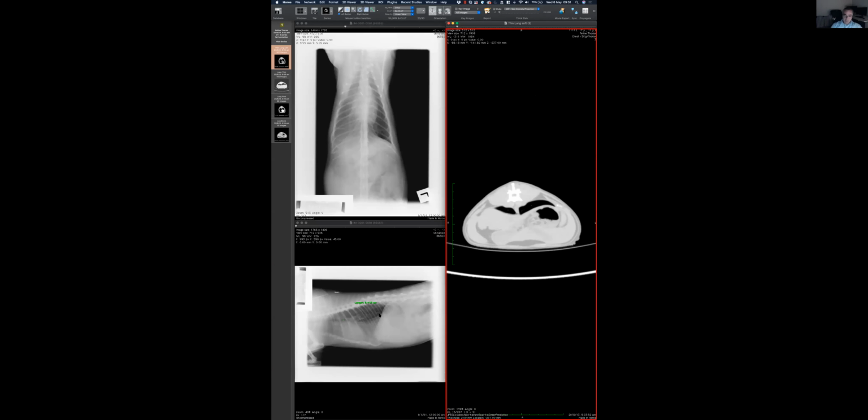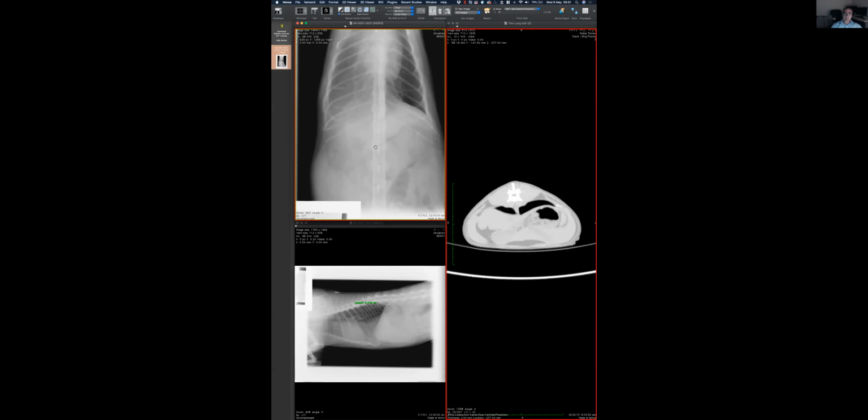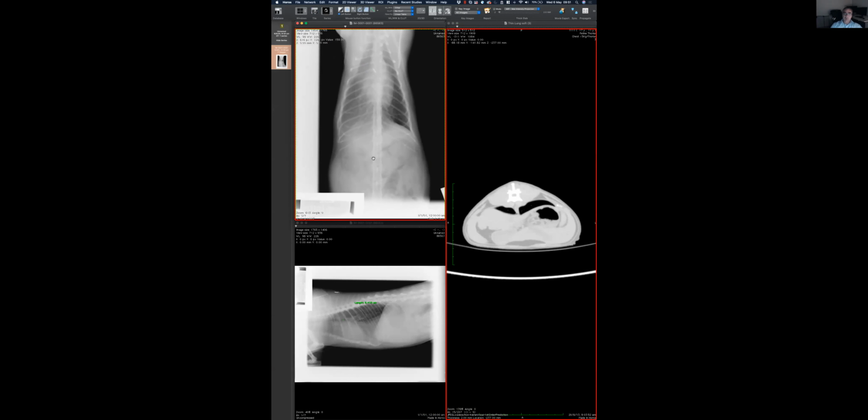Yes, absolutely. Basically, the mechanism is different. In the asthma cat, what is larger is the lung, and when the thoracic cavity gets larger, the diaphragm flattens. In this case, it's because there is a new component in that thorax. But yes, I agree. So basically, we should put this finding, the flattening of the diaphragm, together with this finding, the displacement of the heart.